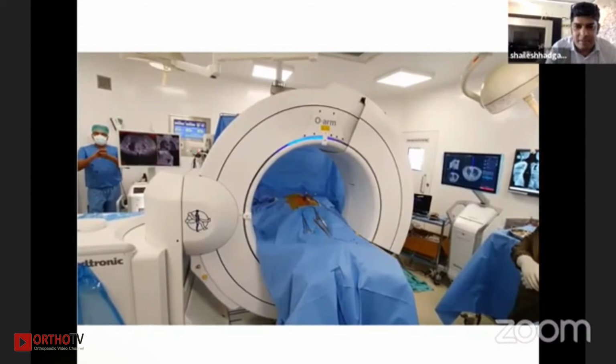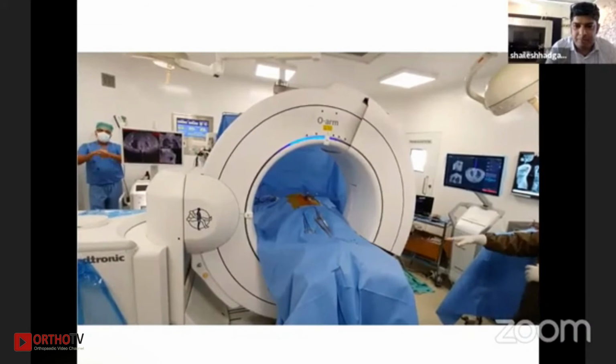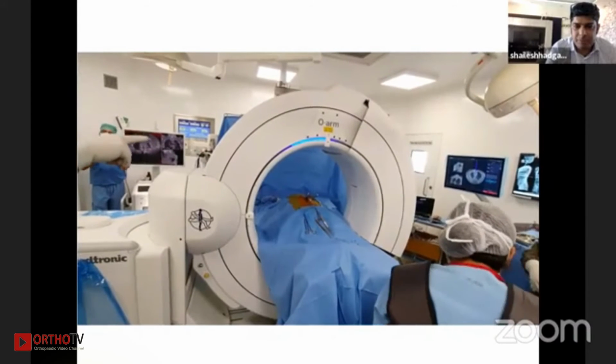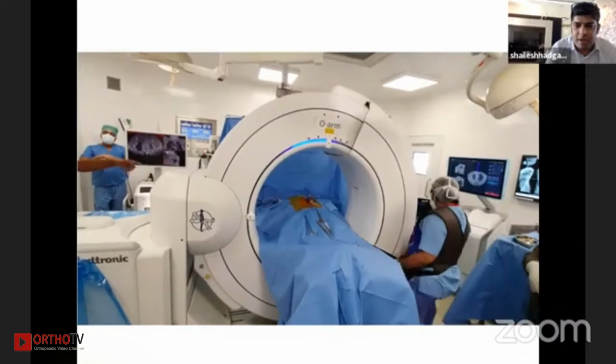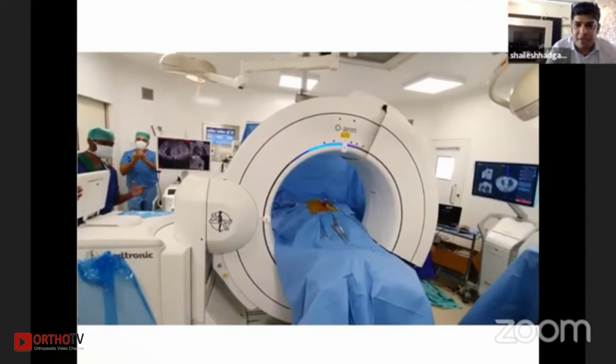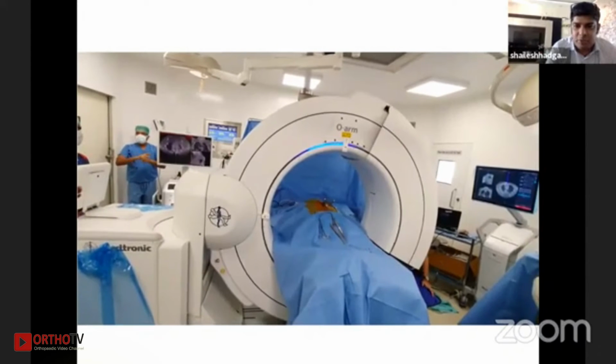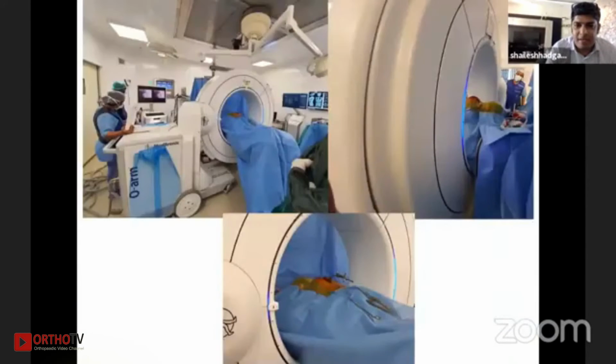It hardly takes a few seconds to do this. I want to see the lateral now. You don't have to move the image. You can see the AP and lateral. You can see the 2D image first, then you can go for the 3D, and that's it. Once you document, life becomes really easy.